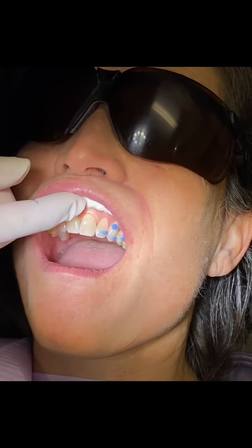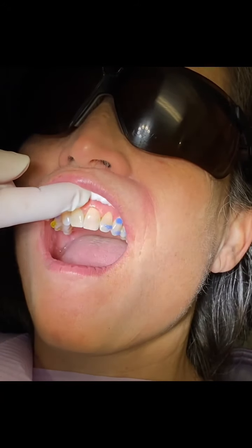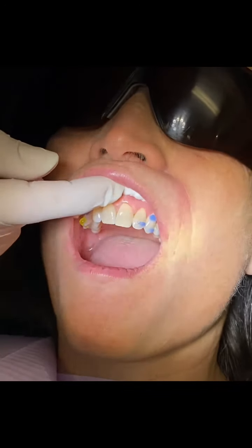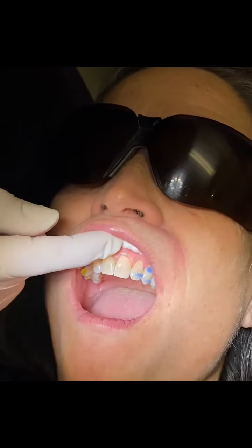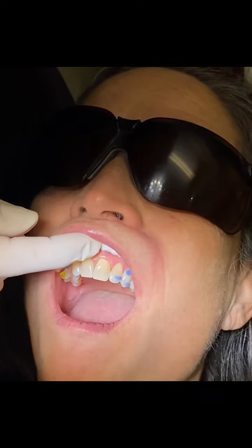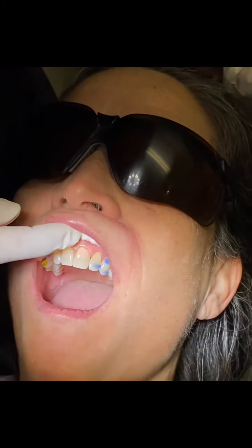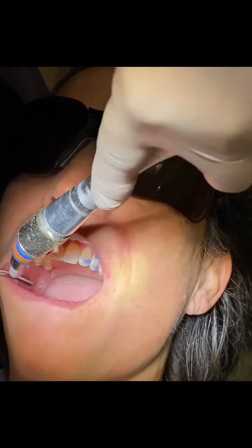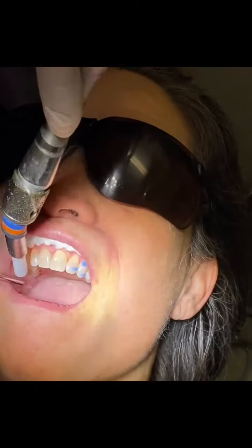The etch is left on — in the porcelain case we leave it on double the time, and where there's no porcelain we leave it on for 30 seconds. Then we rinse it off thoroughly, go ahead with our bonding agent, and the last step would be placing the enamel material inside the template, placing the template on the tooth, and setting the material.